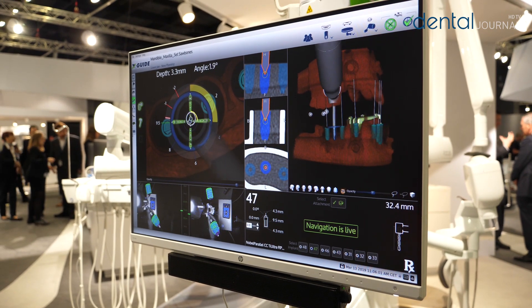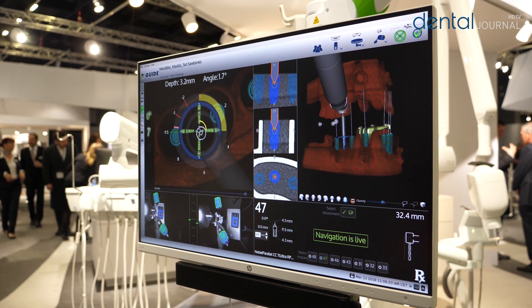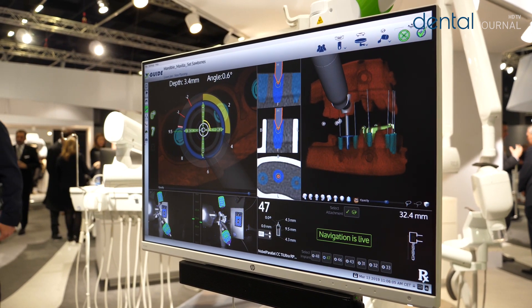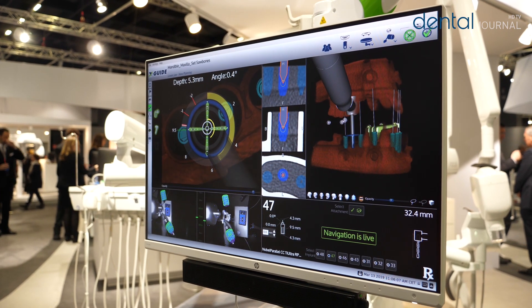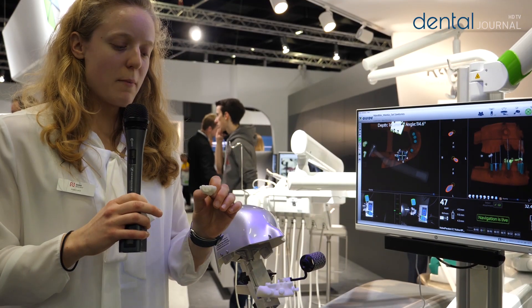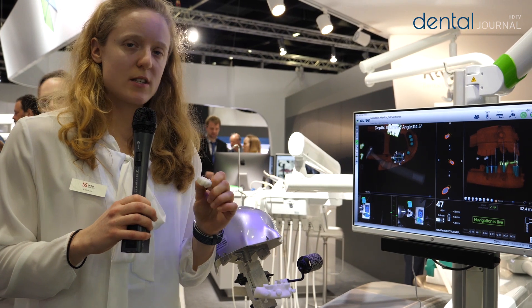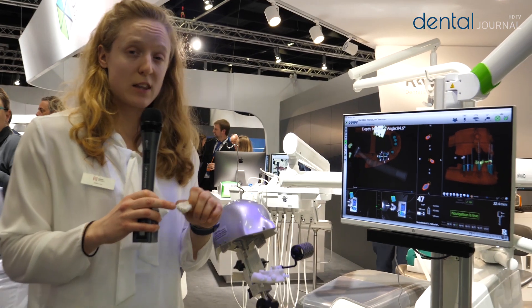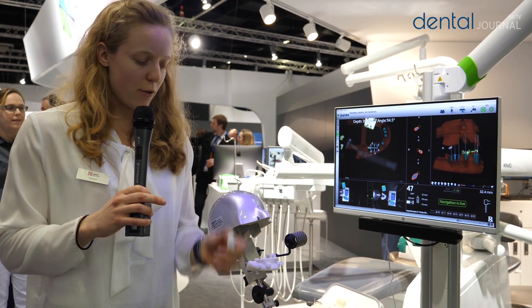So it's real-time turn-by-turn navigation for angle, position, and depth of your contra angle with respect to the patient's anatomy. That combines the virtual world with the patient's anatomy, because the software can detect the position of these three metal markers in the mouth.